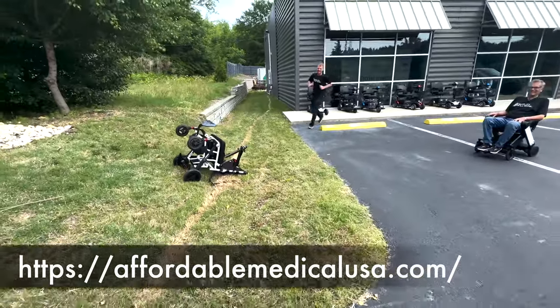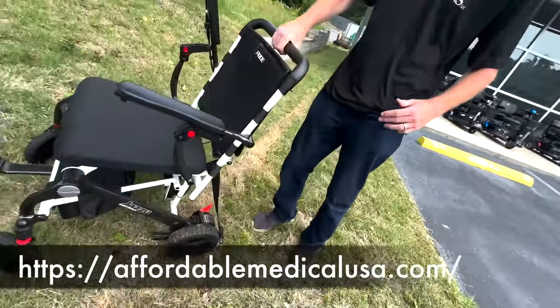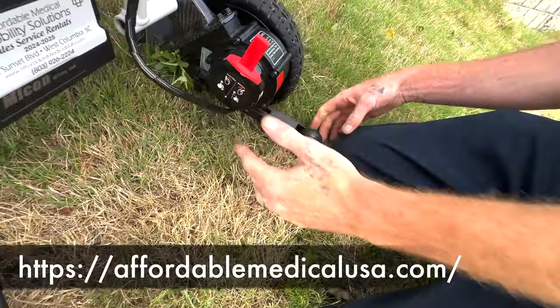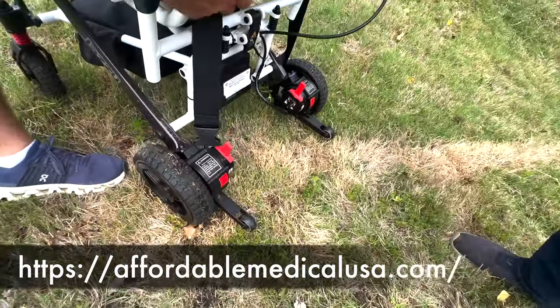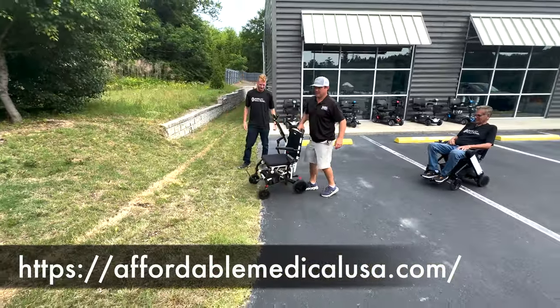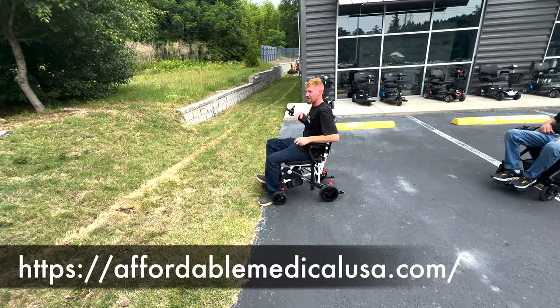Hey, do it again. Make sure the anti-tippers are out. That's crucial. Put the anti-tippers on that thing. Move them out. It's really important to have these out. So, there's the reason why, but at the same time, you shouldn't be going up this. But again, if you're riding this for a long period of time, hey, that was a good ninja move. Anti-tippers out. All right, go ahead.